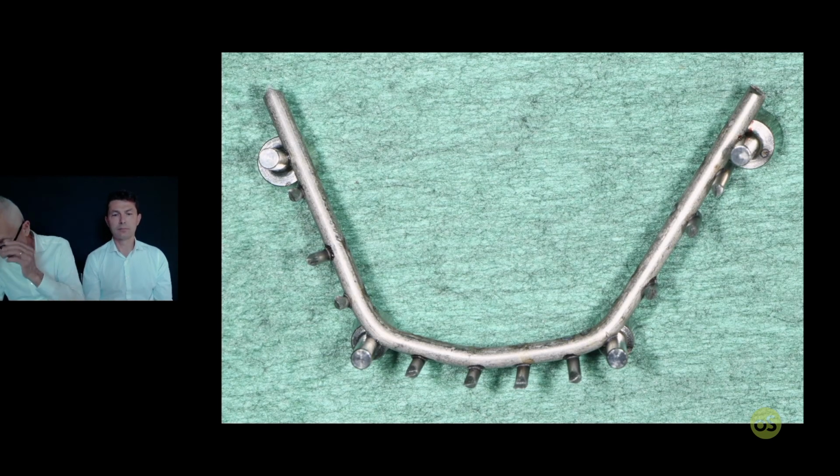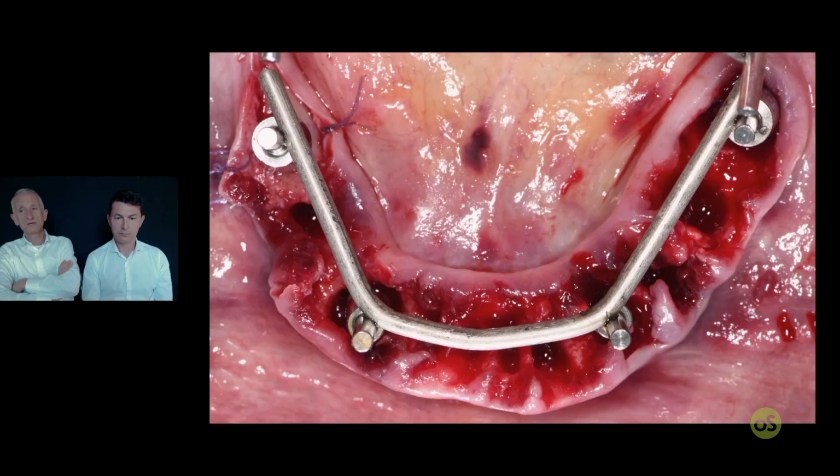So now I have done surgery and the first part of the prosthetic. I can give this to Gianluca, and Gianluca can continue.